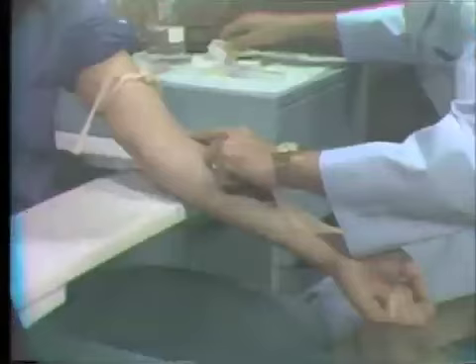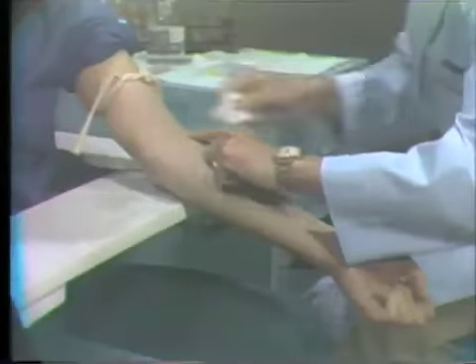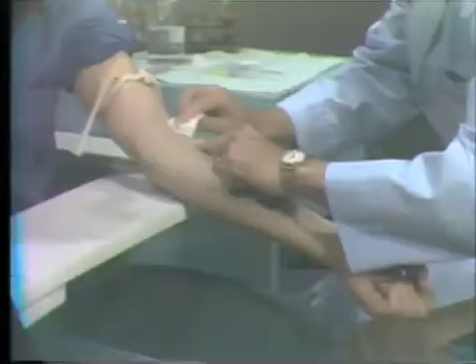Now I know the arm is becoming congested now, but I'm more interested in showing the technique. After you have palpated the vessel, you have an idea about where the vessel lies, if it rolls or doesn't roll, then you will go ahead and clean off with alcohol and then not touch the vessel again. If you touch the vessel again, what will happen is you will contaminate the needle and contaminate the specimen and the patient.